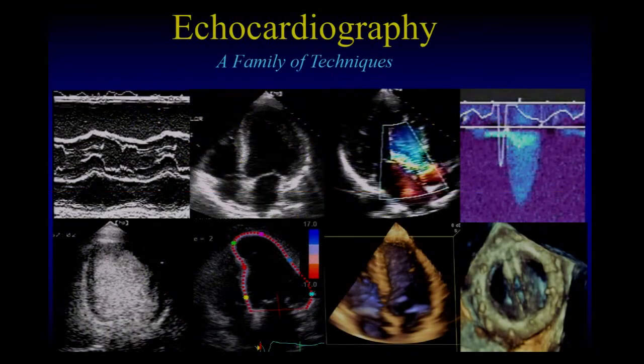Now, for those of us who've been in the field for some time, we've seen it evolve, but many of you who are maybe just starting, it's really nice to start where echocardiography has many applications.